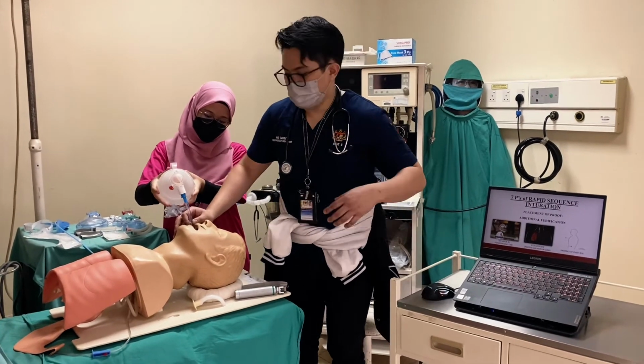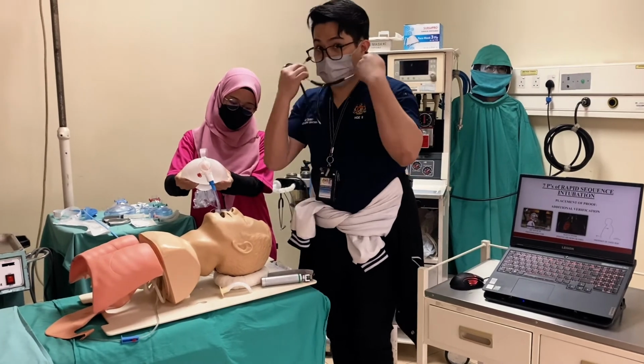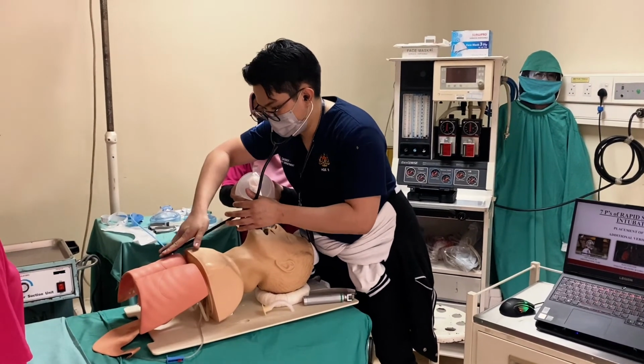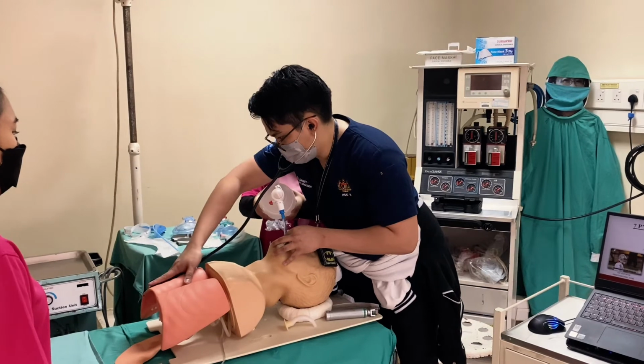The auscultation, where we will be auscultating by ourselves. Check from here. Check. Reading. Okay. We will ask our assistant. Okay. Reading.